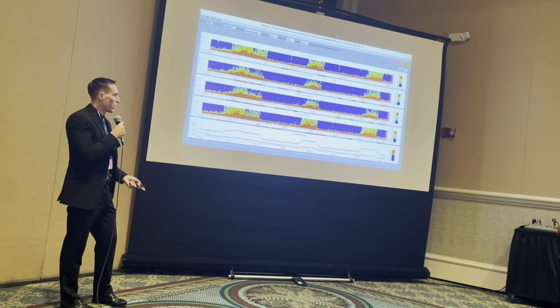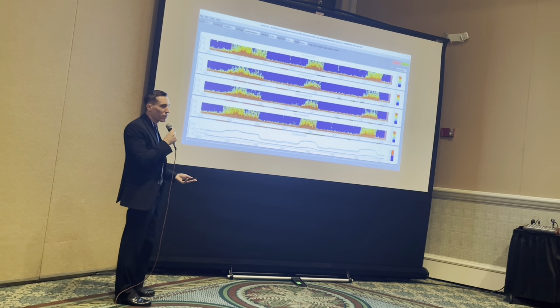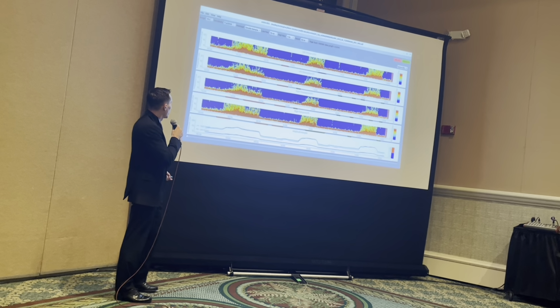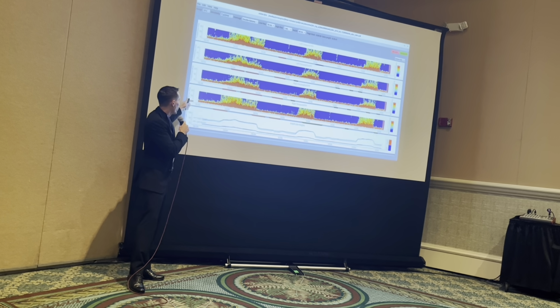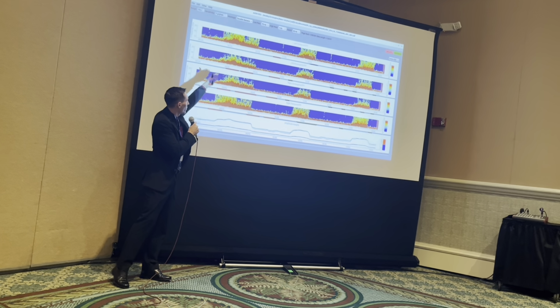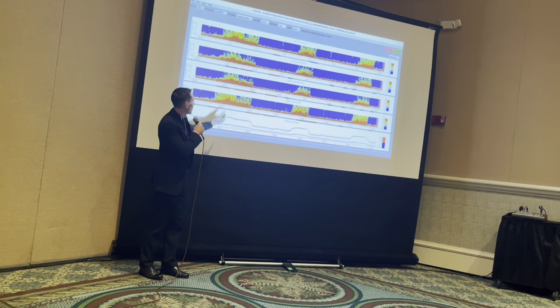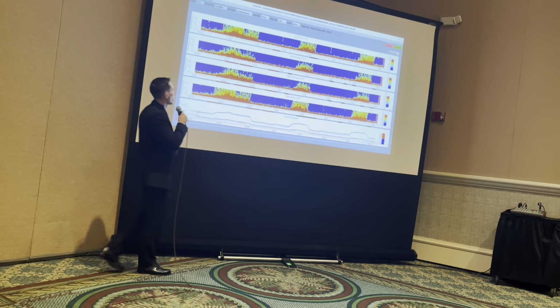Now, here's another example of quantitative EEG. This is looking at the ICU patient we were looking at earlier. In this patient, you've got continuous delta activity at the bottom, and it evolves into 3 distinct seizures. So you've got a seizure here, and a seizure there.